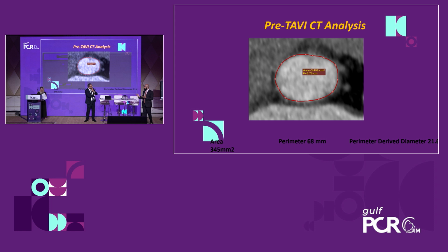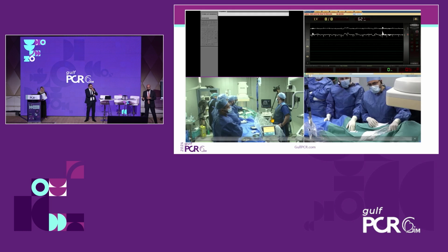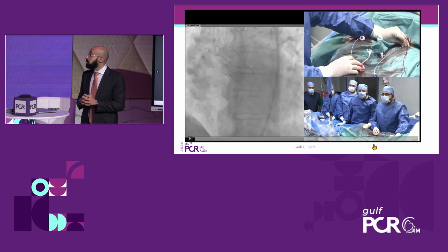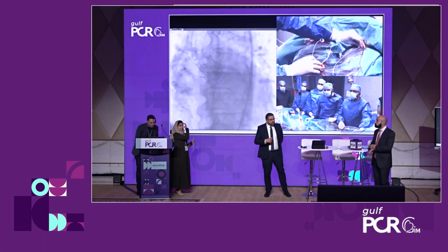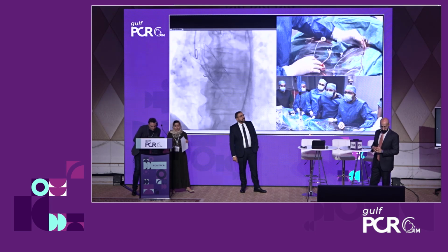And the other important point to elaborate is that actual deployment is in the coplanar view rather than the cusp overlap view compared to the other self-expandable valves. This is another important point to mention here. Right, so you can project it now if you can. So if you can see, the posts are all concentrating on the view.